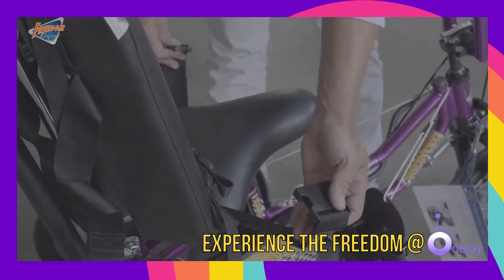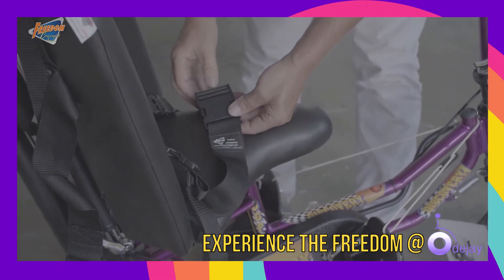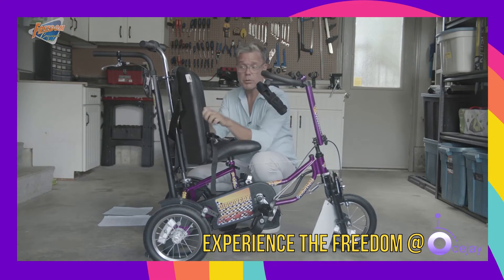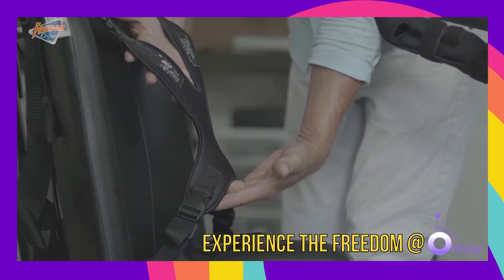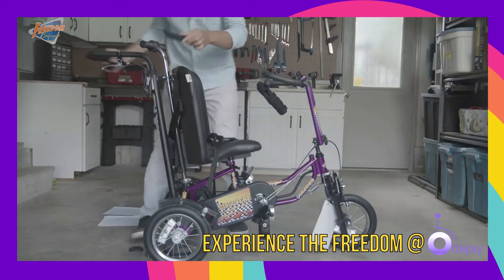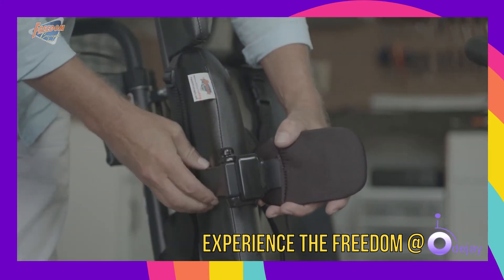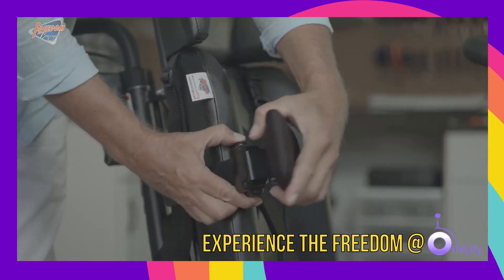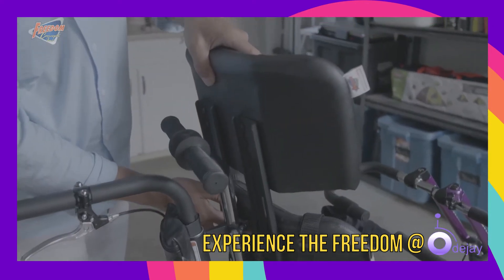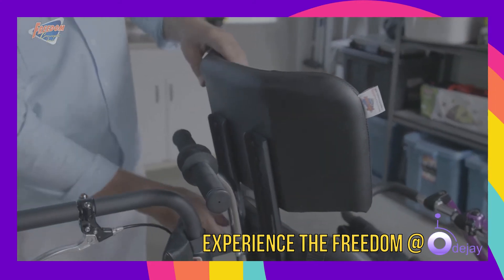All Discovery cycles come standard with a hip belt to secure the rider in place. We also offer a chest belt to come around the chest, and if more support is required, a butterfly strap or chest harness can also be applied. For riders where more support is required, we can install laterals that are height adjustable, width adjustable, and tool free, much like on any manual wheelchair. This particular bike has a high back seat as well as an adjustable and removable headrest to support the rider's entire upper body.